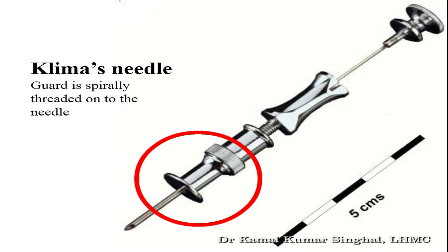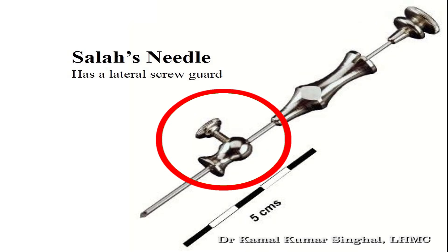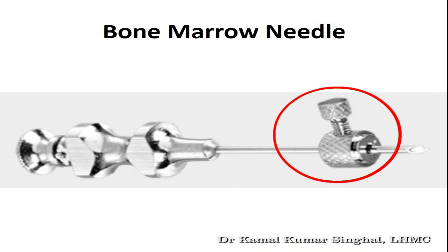This is the Klima's needle, where the guard is spirally threaded onto the needle. And this is the Salah's needle, where there is a lateral screw guard.